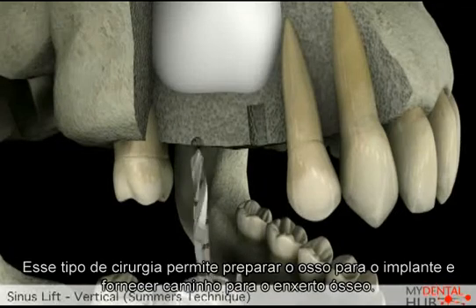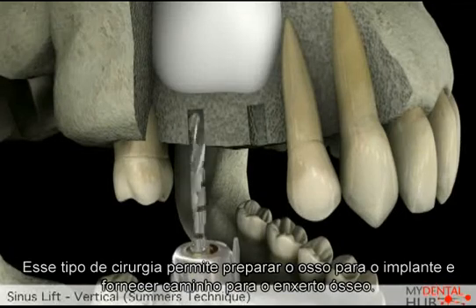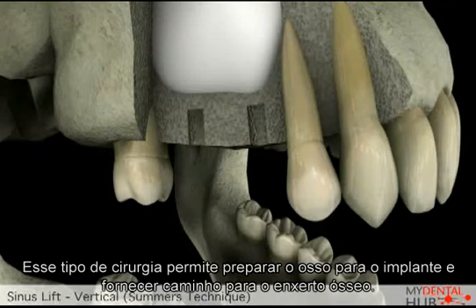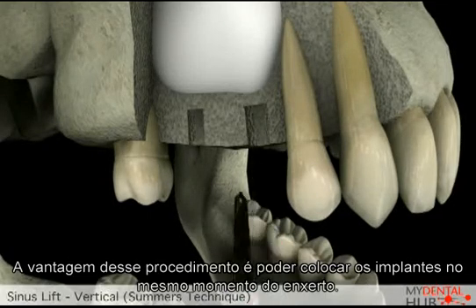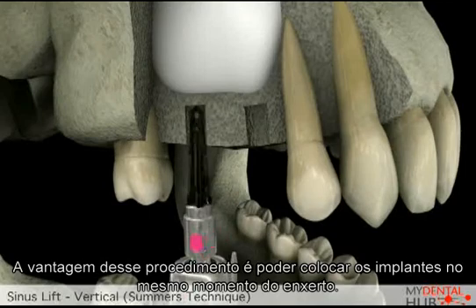This type of sinus lift allows us to prepare the bone for the implants and then perform the lift of the sinus along with the bone graft. The advantage of this procedure is that we can place the implants at the same appointment.